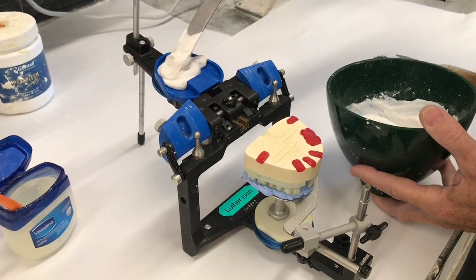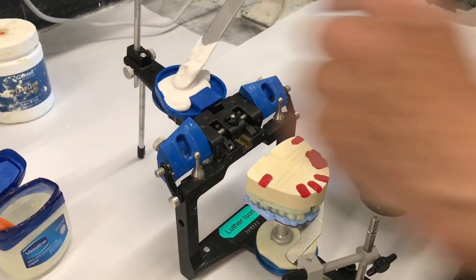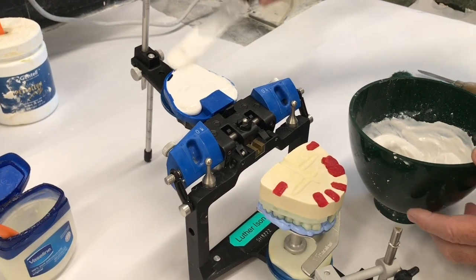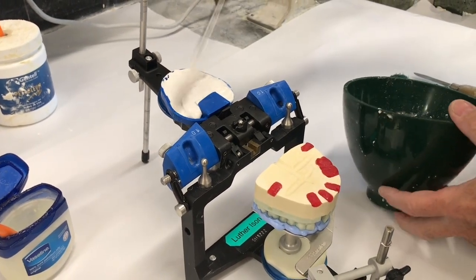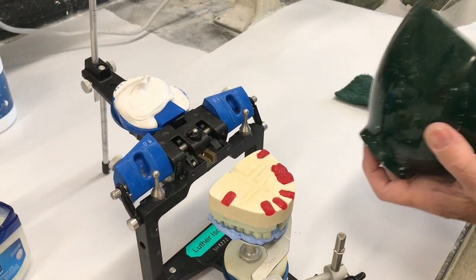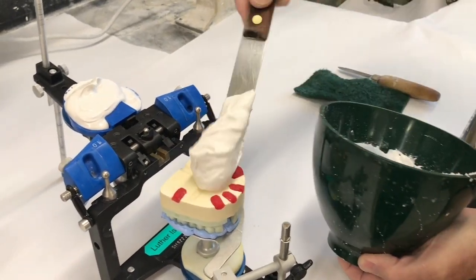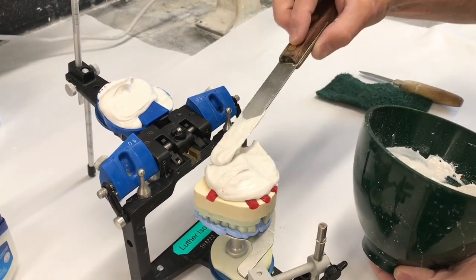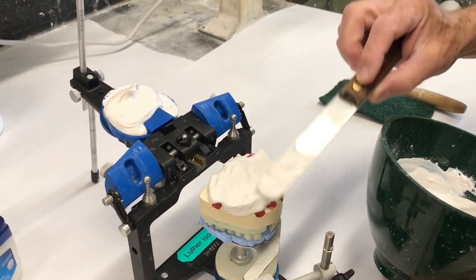Apply it in to the ring. Make sure you get it in these two little tabs, which is where the retention is for these particular magnet-mounted rings. Fully cover the cast, all edges of it, so we don't have any voids.